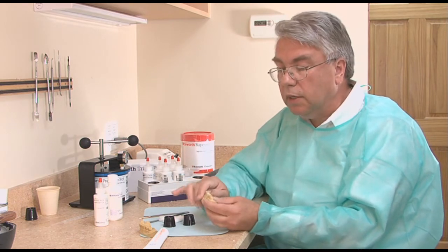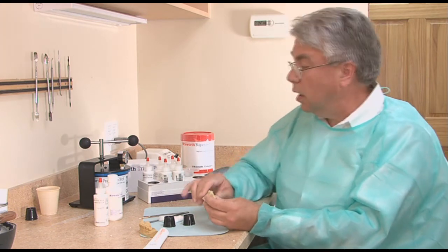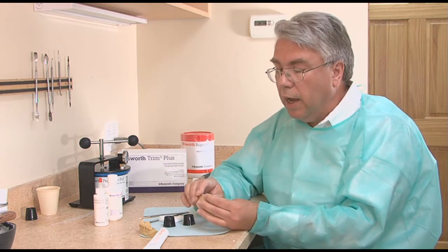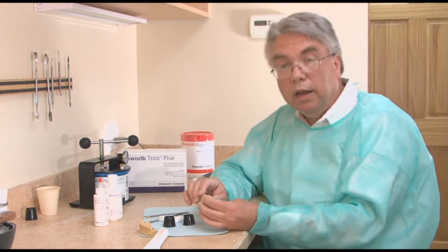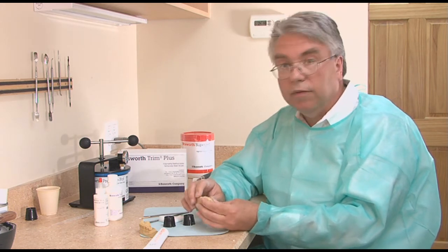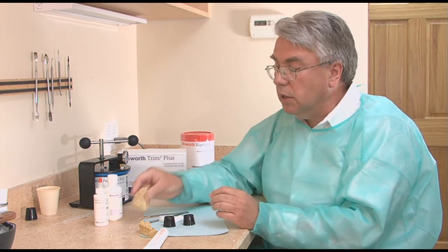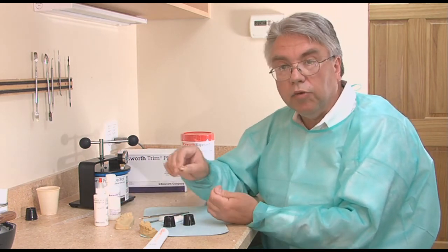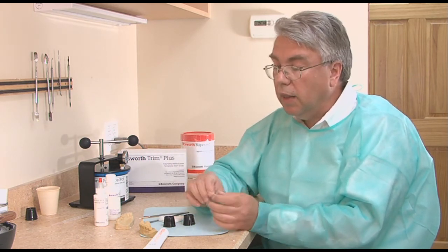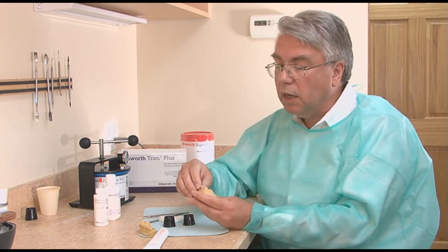Take it out, re-trim it, check the occlusion. At that time I will have it polished. Pumice is a great polishing product. I sometimes have my staff use profi paste — a medium or coarse profi paste, then eventually a fine profi paste on the crown. The tooth is cleaned off again, and the inside of the temporary crown is cleaned out because it did have the lubricant in it. Then I use a non-eugenol cement and re-cement it onto the tooth.